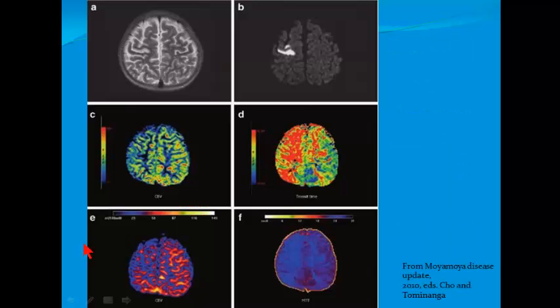Now, here's a patient who, you can see there's a bit of an enhancing lesion, an 11-year-old girl with a stroke or with an infarct, and we can see on the diffusion weighted images this area of increased signal within the right frontal region representing an infarct, because where there is an infarct, there's increased edema, and the edema prevents the migration of contrast and water molecules. And what this does is it picks up on that reduced diffusion and we see a higher signal.